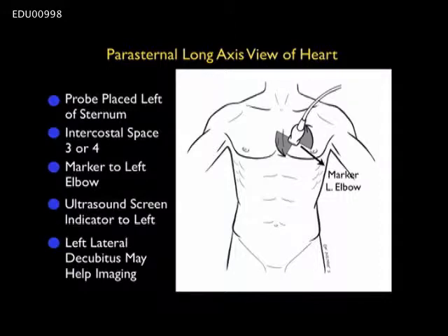Let's review how to perform the cardiac evaluation beginning with the parasternal long axis view. We want to use a smaller footprint phased array probe that can easily fit between the ribs to get a good view onto the heart. We'll generally begin in intercostal space three or four with the marker dot on the probe down towards the patient's left elbow — with the caveat that the ultrasound screen indicator is maintained toward the left of the screen. Moving the patient into left lateral decubitus position may aid assessment by moving the heart closer to the chest wall.